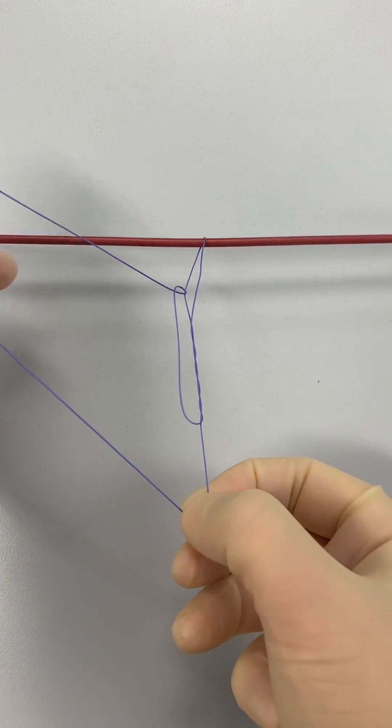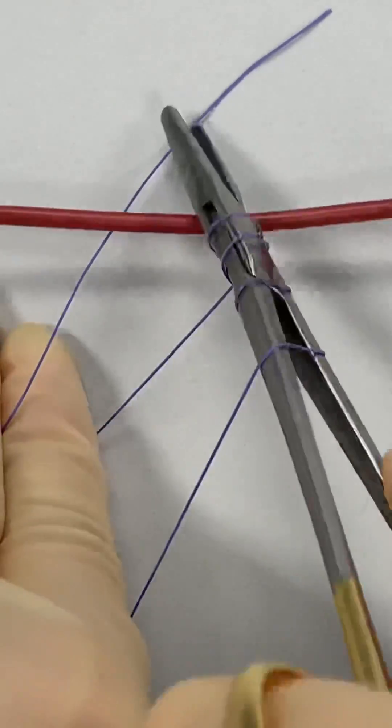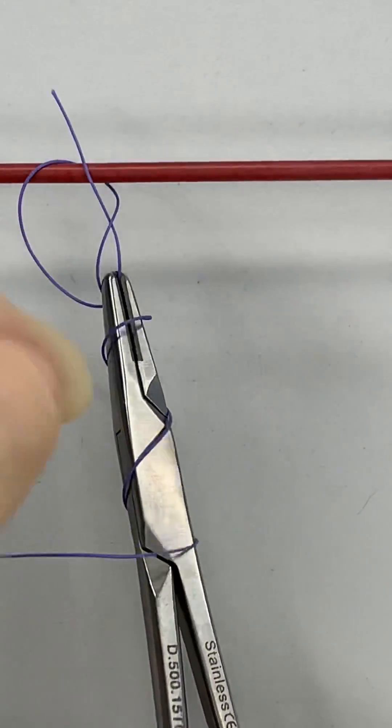But here's a more secure surgical sliding knot. It starts off with 4 throws of suture material over the needle holder. The short end of suture material is grabbed and pulled through all 4 loops.